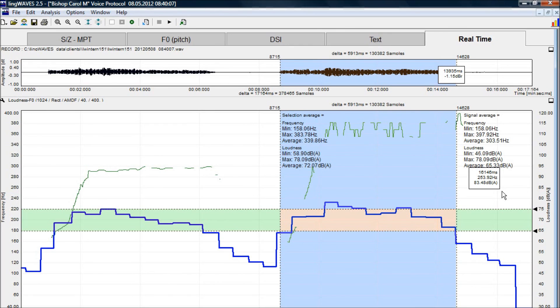That's the last screen in the LingWaves voice protocol. I hope you enjoyed it.